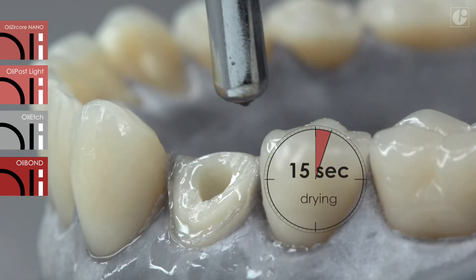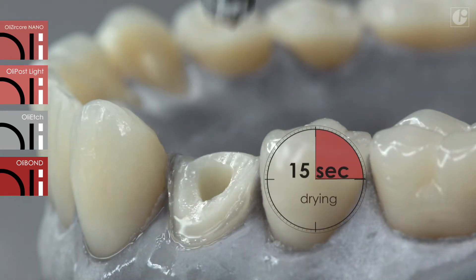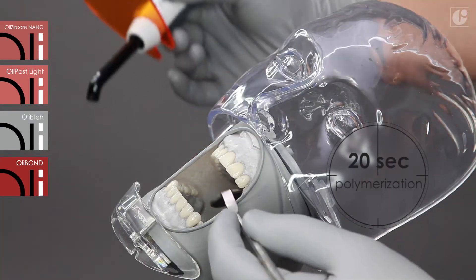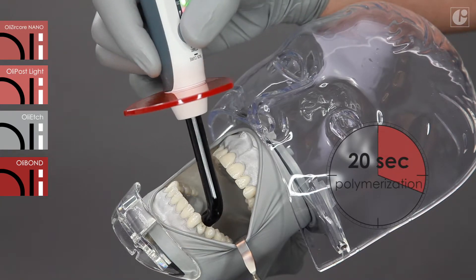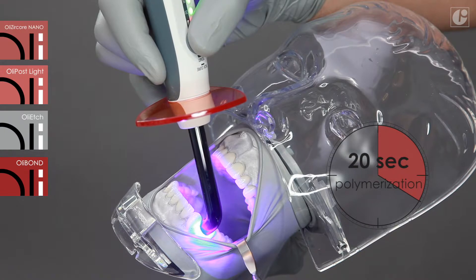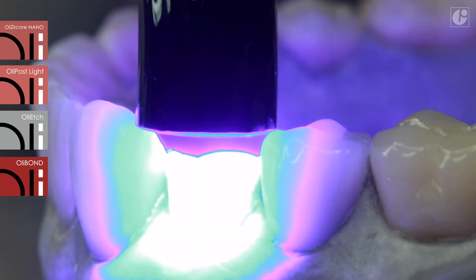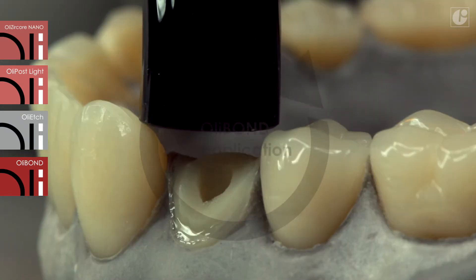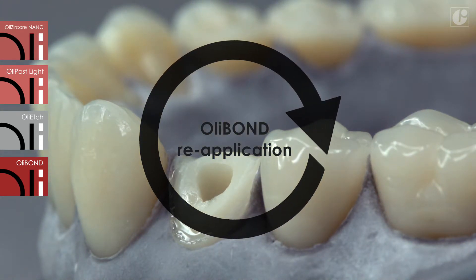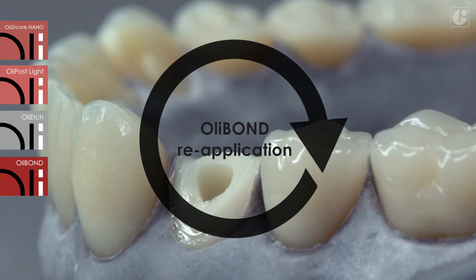Gently remove excess amounts using paper points. Dry with a delicate stream of air for 15 seconds and polymerize with light for 20 seconds. After that, the second layer of OliBond with OliActivator can be applied in compliance with the presented procedure.